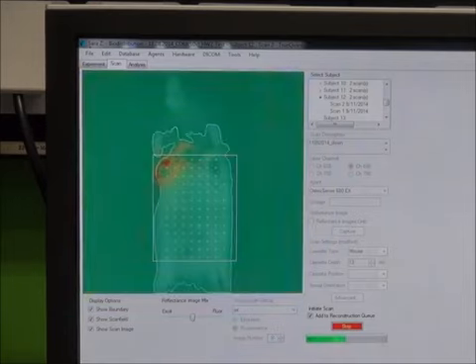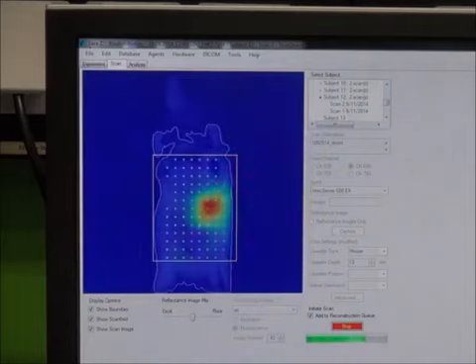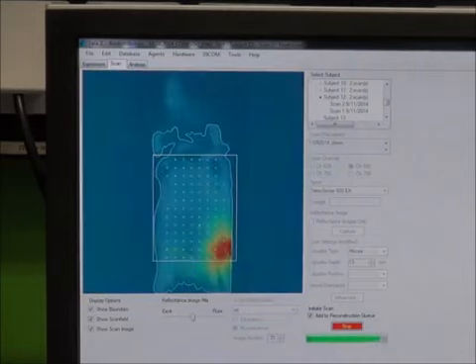This is because the organs with higher relative blood volume, such as heart, liver and kidneys, are more in the upper body. Blood is the main absorber for near-infrared light. The second pass runs over the same source points with a different filter, which only lets the fluorescent light pass through.